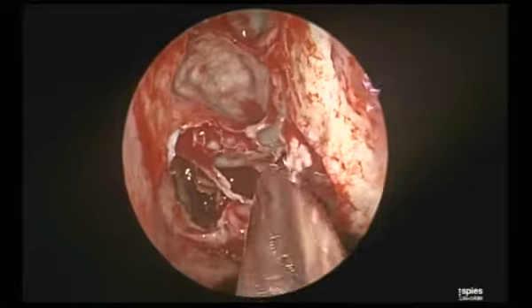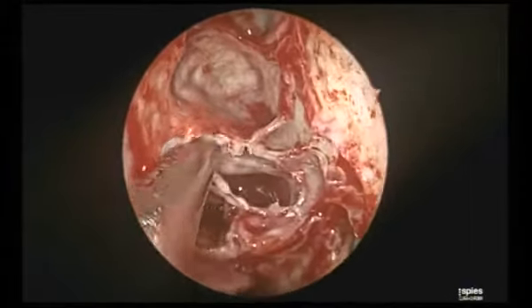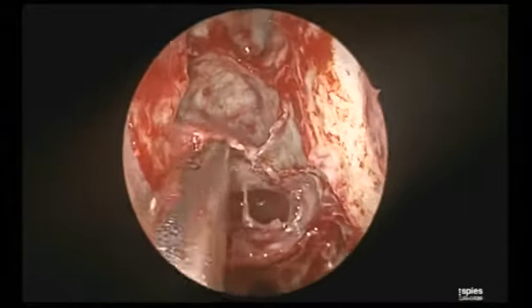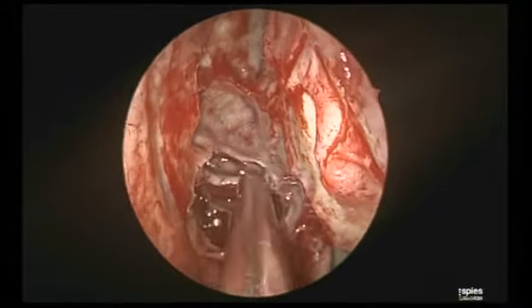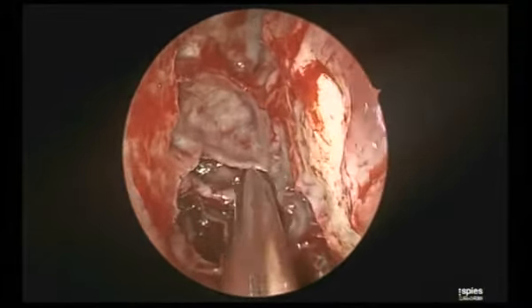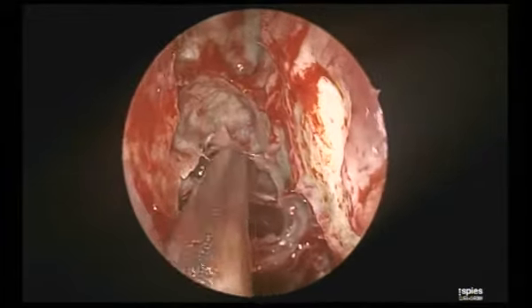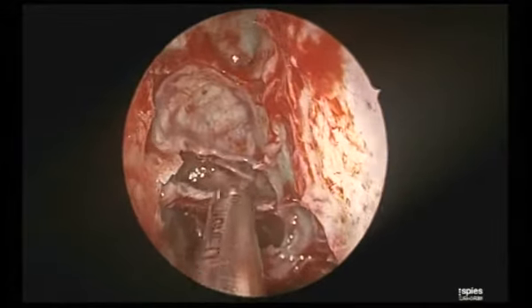Width before depth. He is able to take away a lot of the width, expose really well, and he's not working through a tunnel. All these cells have to go away. And then he is going to, I don't want this patient to be reoperated again and again. If I leave some of the cells behind, it is the same story of chronic sinusitis with cellular blockage, mucin, polyps coming back.